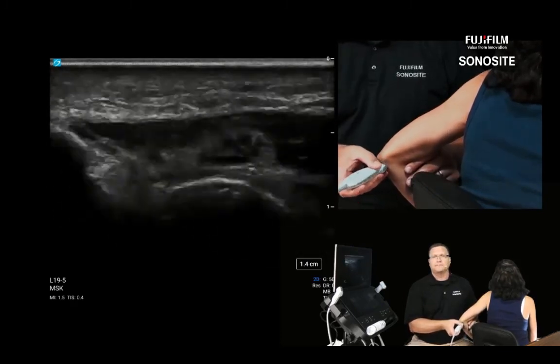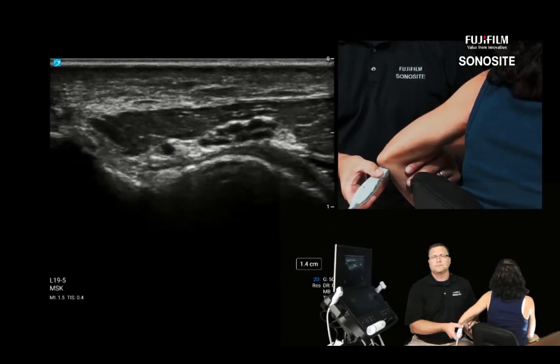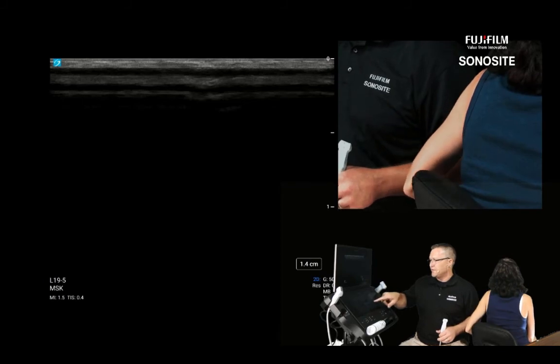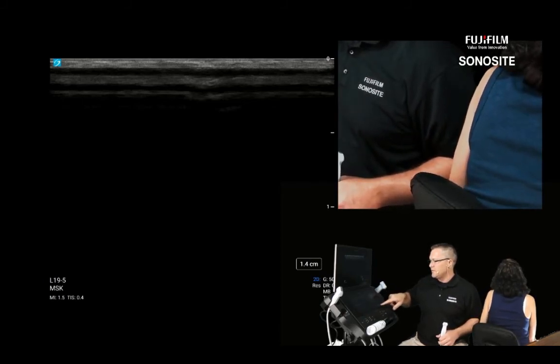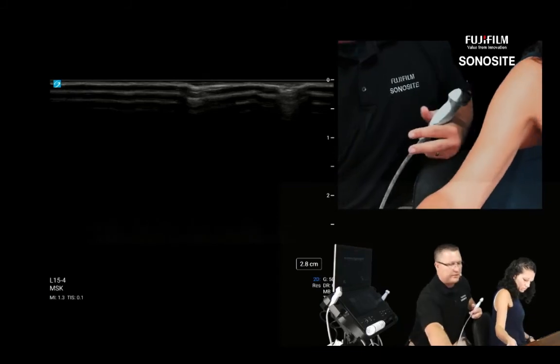Daniel? Yes, Bill? We have one question here asking for alternate views of the distal bicep tendon. Could you show us a couple alternative ways? I would be glad to, and anybody that wants to stick around for an extra 2 or so minutes, I'd be happy to show this. Otherwise, the content of the webinar is basically complete.